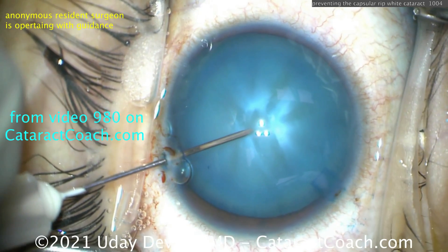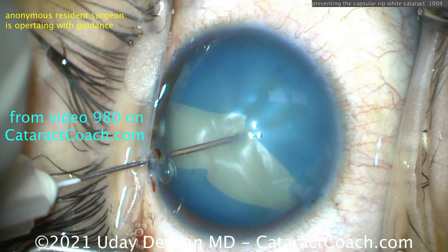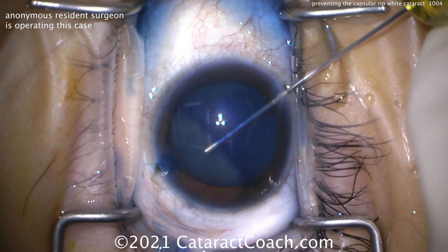Let me show you what happened to the first eye. We poked in with the lens and boom, it splits like that — we're in a world of trouble. That's video 980 if you want to check that out.